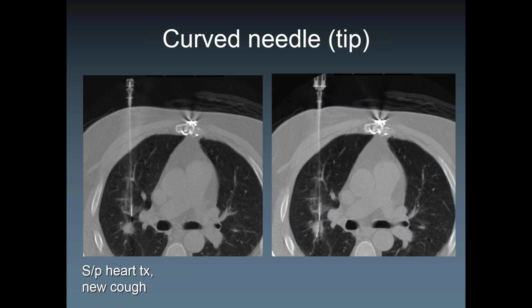Then you would have to bend it the way we discussed, and this is one of the few images which we obtained with the needle exposed. You don't need to do that, but for different purposes, reasons we did. In this case, to nail down basically and verify that the exposed needle is really in the target, we take a shot with the exposed needle, and that shows that it's clearly in the target.